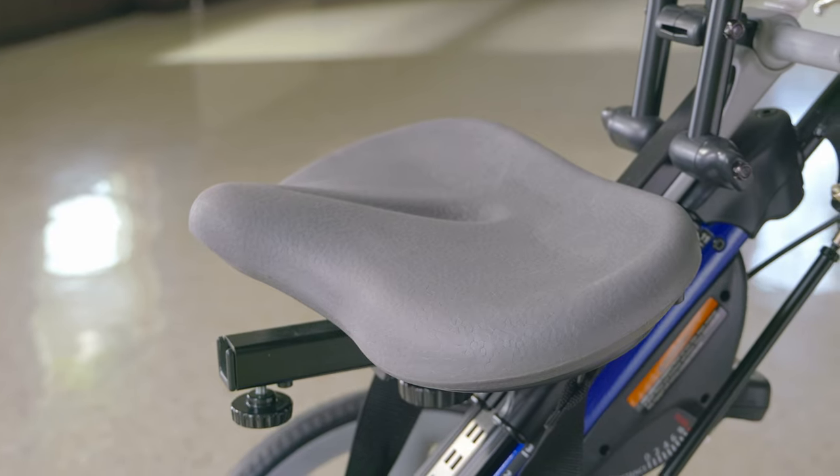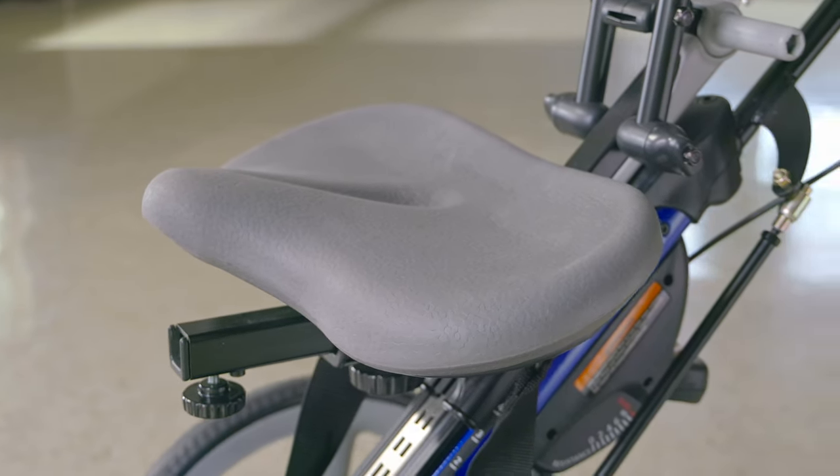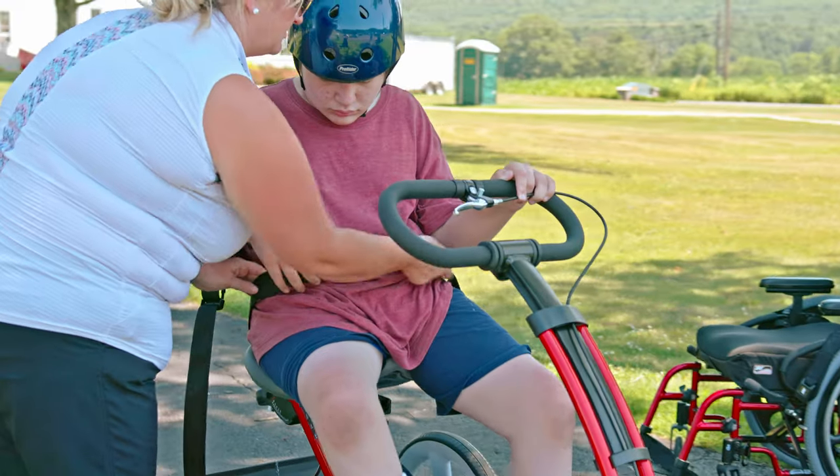The large seat provides sitting stability for people with poor balance. It's contoured to create a sensory boundary around the hips and buttocks, while allowing for free range of motion and hip extension during cycling. Every trike comes with a seat belt.